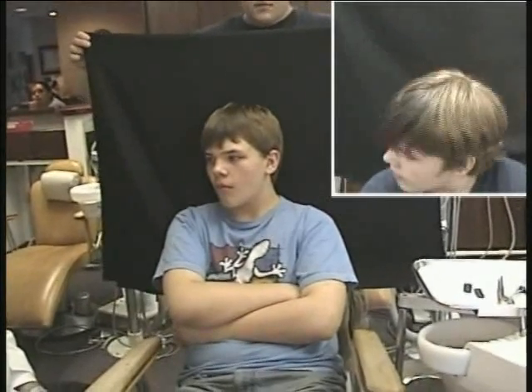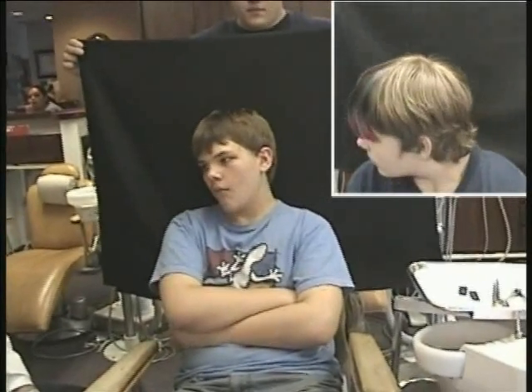In the 5 minutes time that the patient has been sitting here, he and I have had a heart-to-heart talk about wearing this full time. And he must wear it constantly when he eats, kisses all the pretty girls in high school, talks and gives reports in class, etc. He has to function with it 24/7, or else it won't do him any good, and he will only be a partially treated Tourette's patient. And that's not good enough for me or for him.